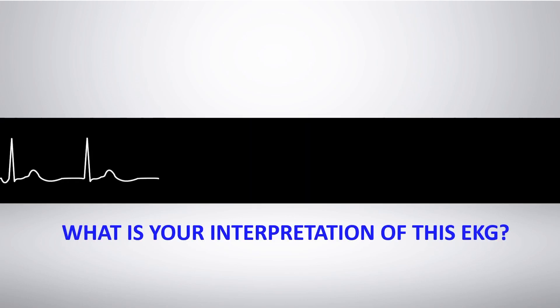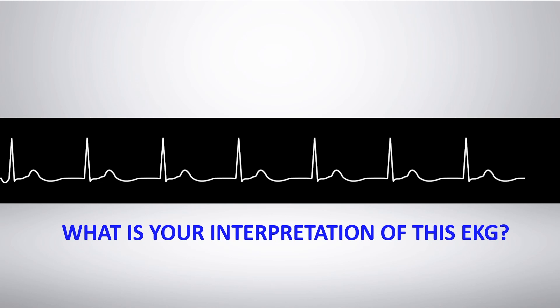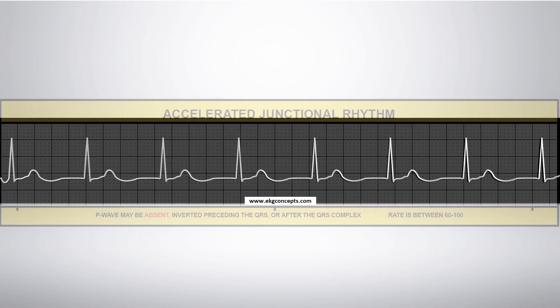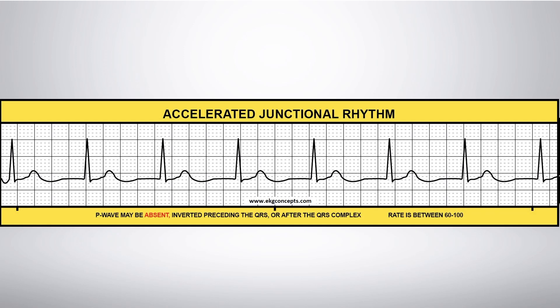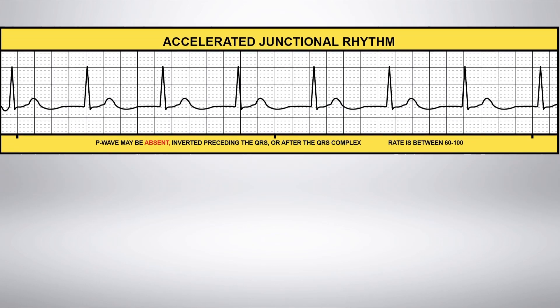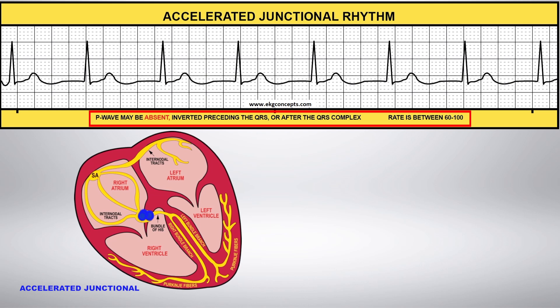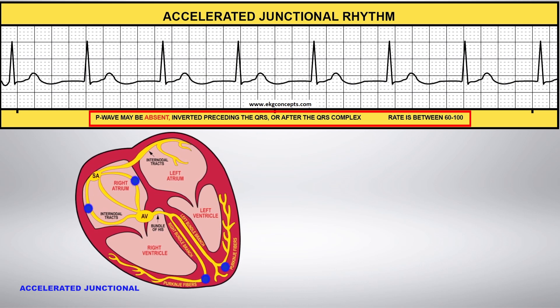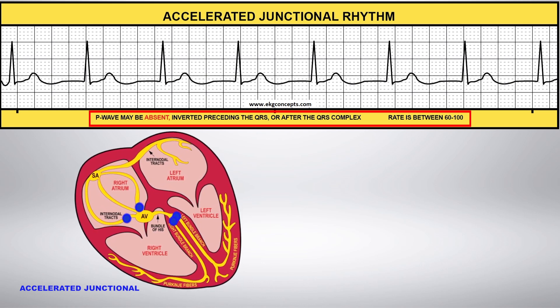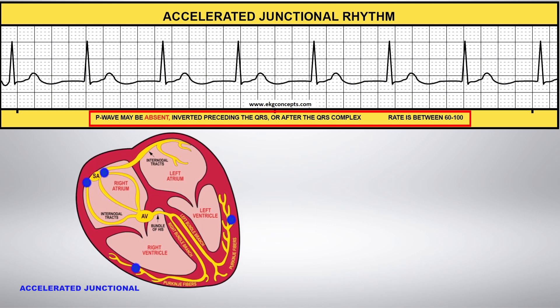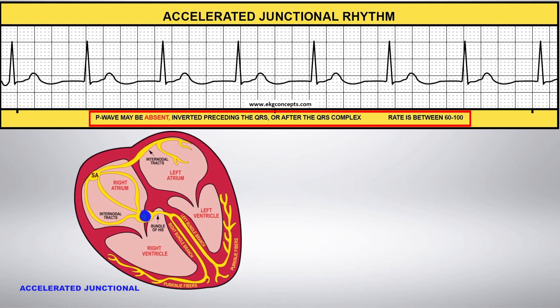What is your interpretation of this EKG rhythm strip? Accelerated Junctional Rhythm. Just like any junctional rhythm, the AV node, or the tissue surrounding it, takes over as the primary pacemaker. With accelerated junctional rhythm, the heart rate is between 60 to 100 beats per minute.